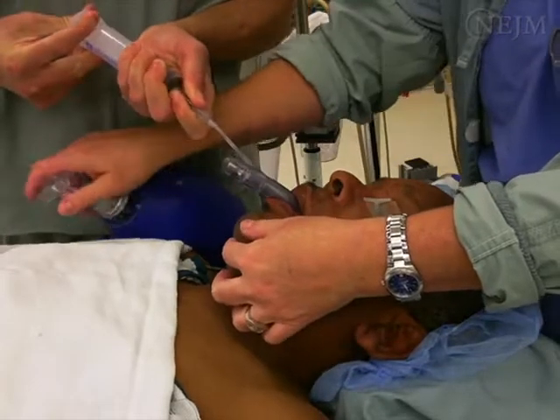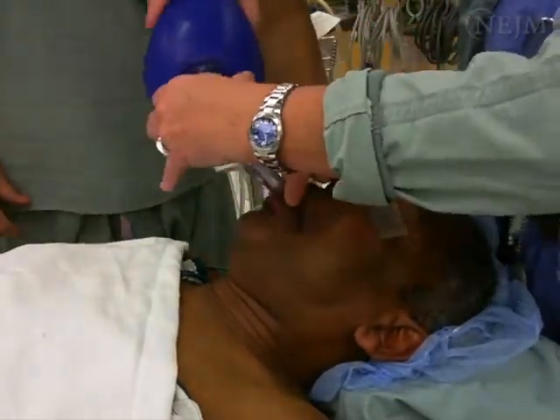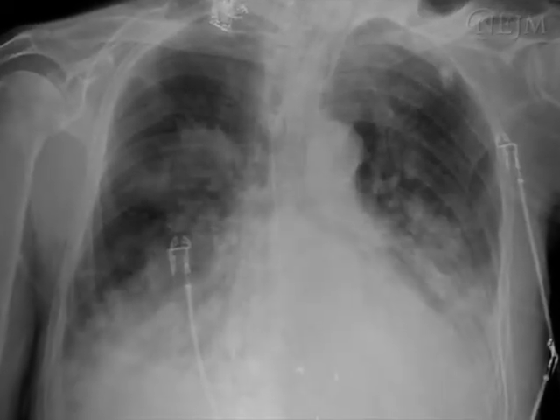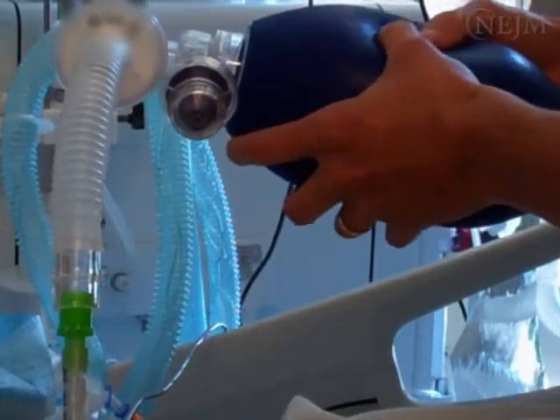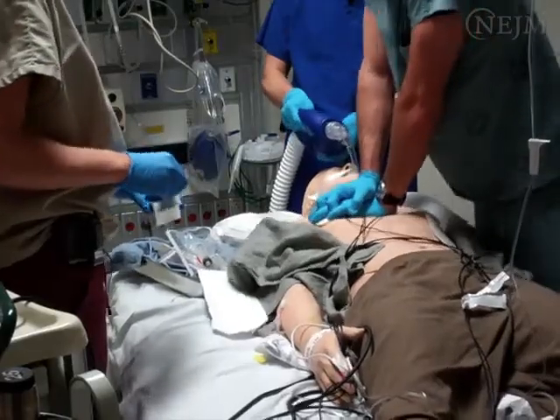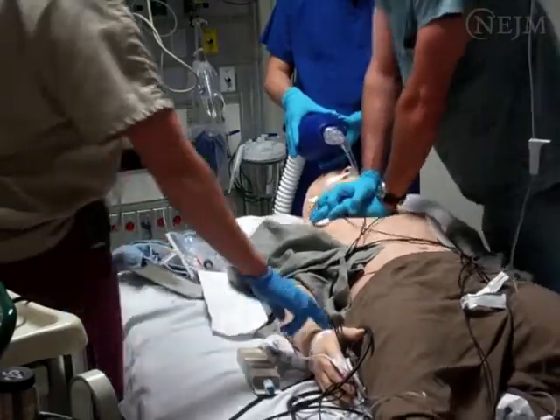Despite its numerous advantages for rescue ventilation, the laryngeal mask airway does not provide a secure airway and will not protect against aspiration when the volume of gastric contents is large. It may also be difficult to ventilate a patient with a laryngeal mask airway when high airway or thoracic pressures are encountered. For example, during vigorous chest compressions, or in obese patients, or patients with parenchymal lung disease.